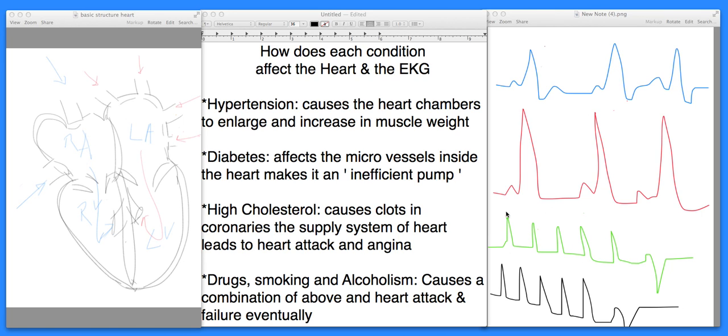Palpitations, for instance. Now, you see how this beat goes? Beat, beat, beat, beat, beat, and then there's a pause, and then there's an abnormal beat in the opposite direction. So that's called palpitations, or sometimes we call them skip beats. Now, here's a skip beat. This is a skip beat or a premature beat. So just familiarize yourself with these terms right now as we go on to the details later on during the session, but the whole idea is wanting to have you familiarized through this strip.